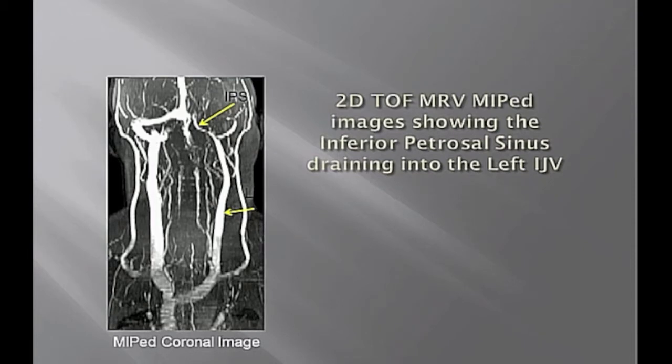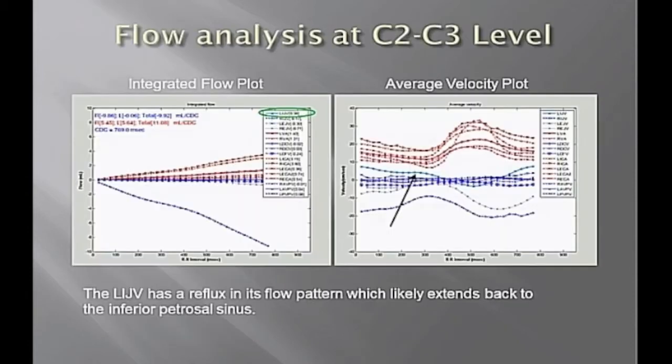Okay, well, this looks pretty normal, right? I mean, it's not too bad otherwise. If I wasn't looking at the upper part of the brain, you might say, okay, he's normal. Well, let's look at the flow. This person is another dramatic example of a person dominated by one jugular. Those other vessels, I see them because I used a contrast agent. Blood flows through them very slowly.